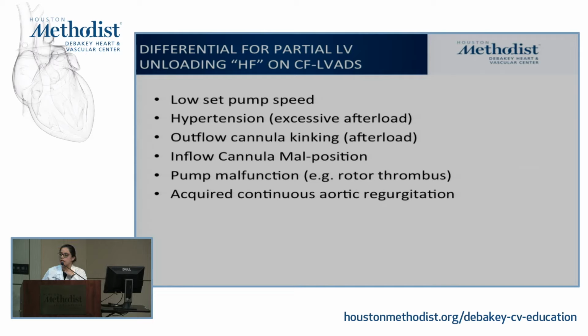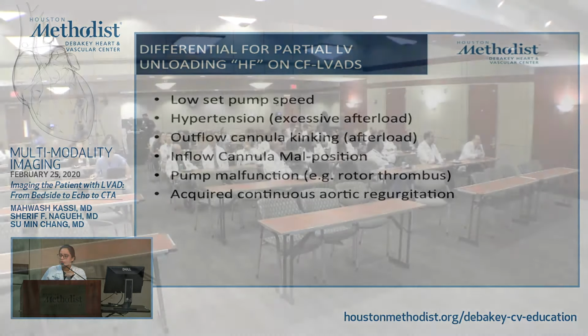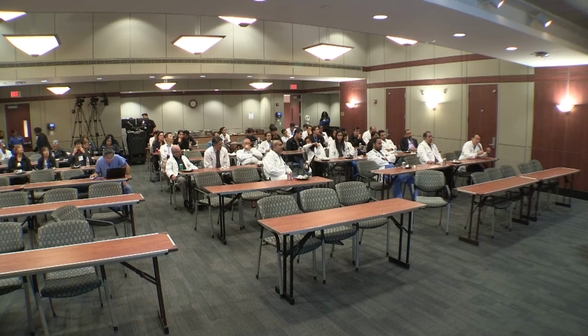Echo information is important, but echo information alone should not be used to determine what's the optimal speed. That's my main mantra here. So I don't use echo on its own unless I'm looking at one specific thing. I get concomitant echo and cath information. With precision, it will be hard with echo to get the precise stroke volume, a precise wedge, a precise RAP. It can tell you where they sort of fall, but it looks like you're titrating to certain values.